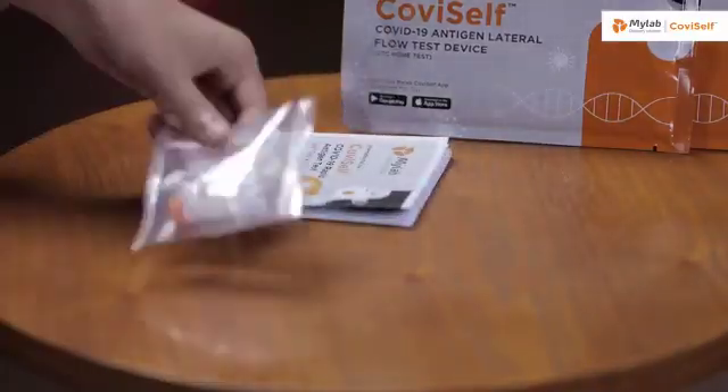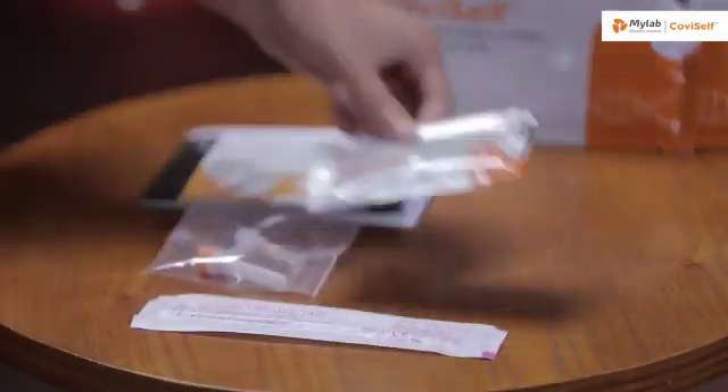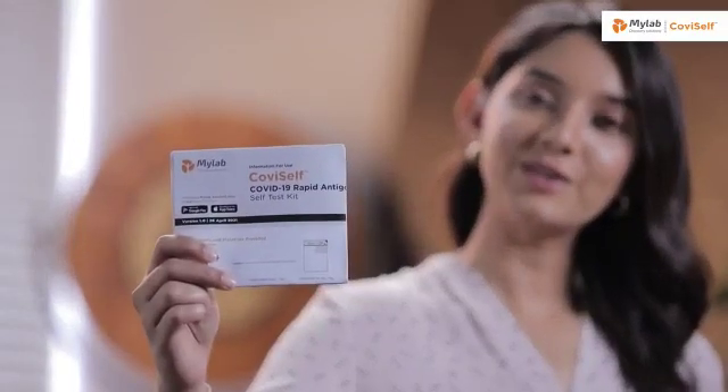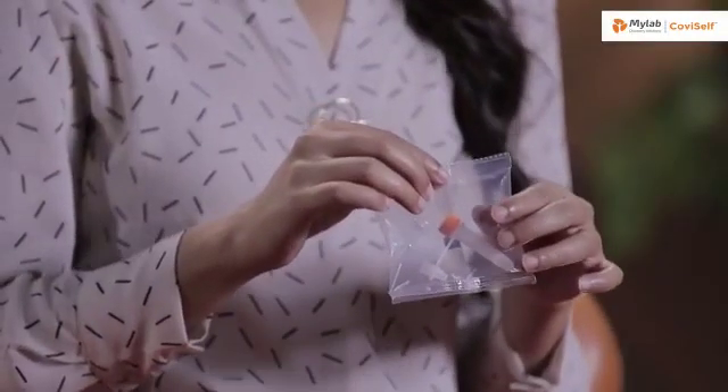Lay the contents of the kit on a table and I will walk you through them one by one. This is the instruction manual. This is a pre-filled extraction tube.